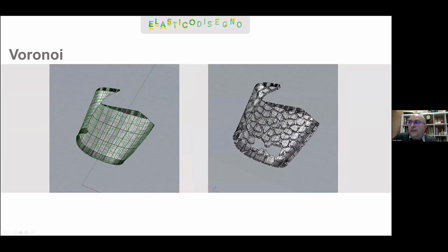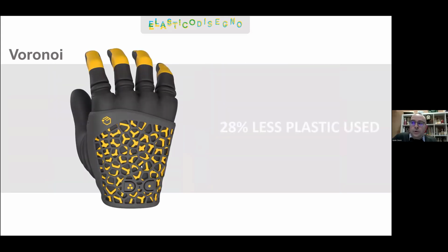This, in the end, allowed us to generate a whole set of solids, which again we brought into Creo to carve the covers and remove material. So you can see here that there is a set of Voronoi pattern that cuts from the middle of the thickness of the cover towards the outside, and the other one from the middle of the cover towards the inside. This coupled with the ability of printing in color.